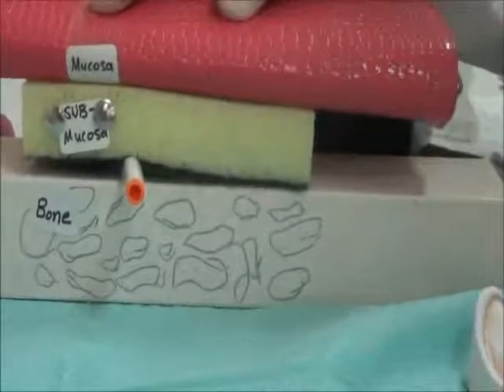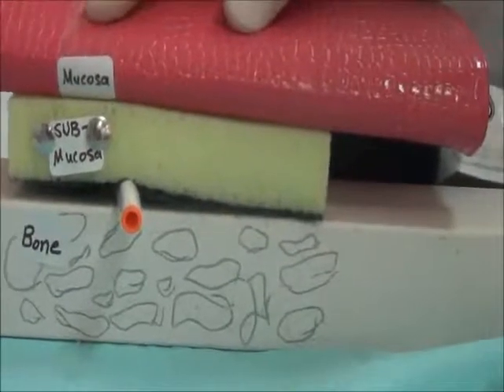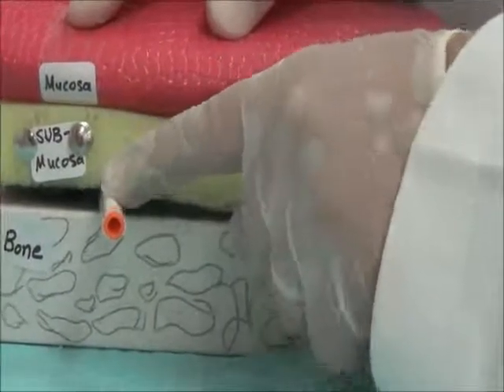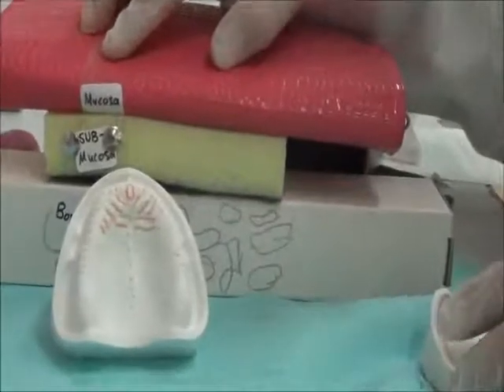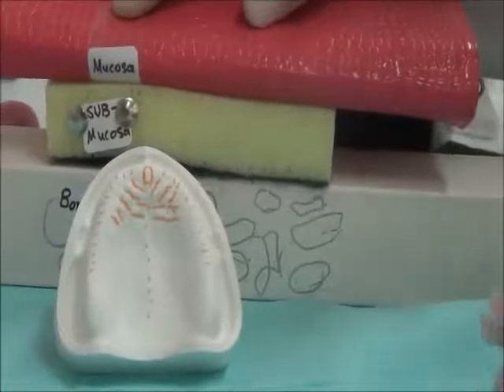The third reason sometimes why we need to relieve an area is the presence of bone spicules. These sharp bone spicules can be present in the form of the mid-palatine raphe. Underneath it we have the bone where the suture had closed, and that bone is projecting.